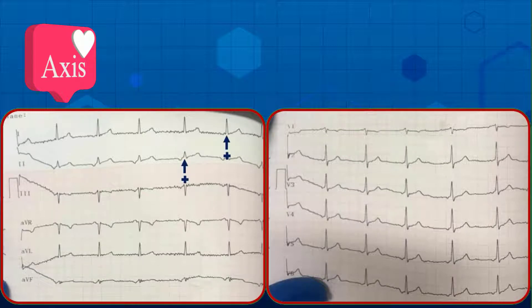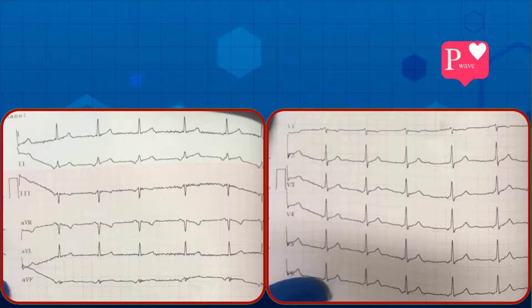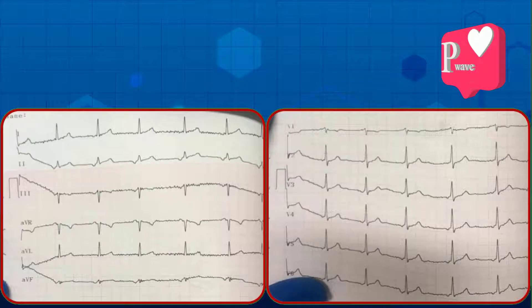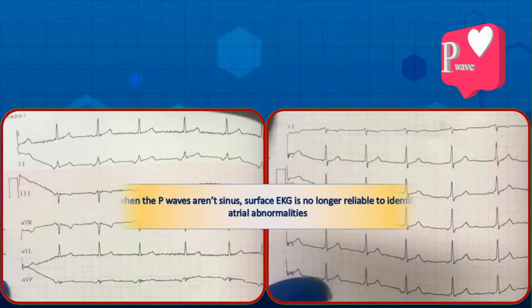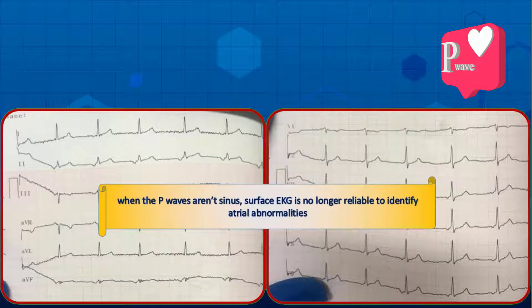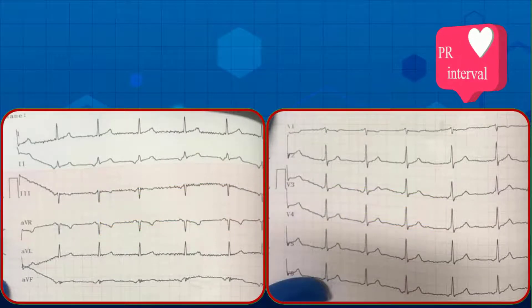Fourth step is axis analysis. The QRS complexes are positive in both leads 1 and 2; therefore the axis is considered normal. Next, regarding the P waves, as we already said, the P waves are originating from the atria not the sinus node. Remember that when the P waves are not sinus, the EKG is no longer reliable to identify atrial abnormalities.